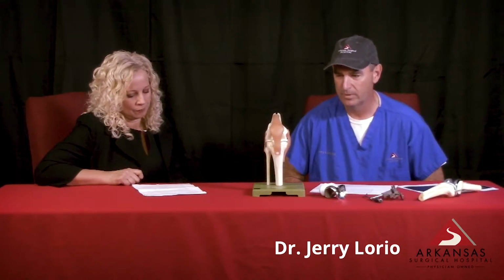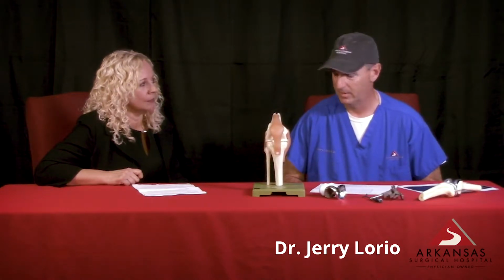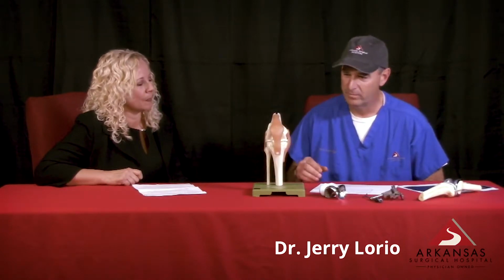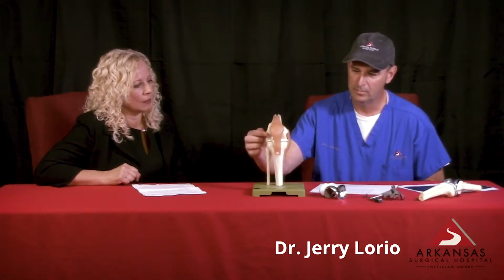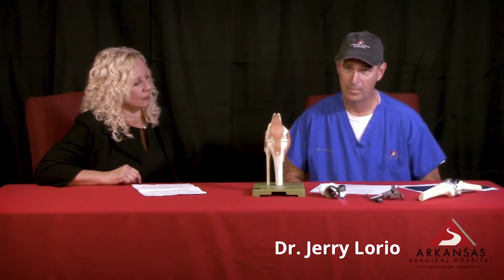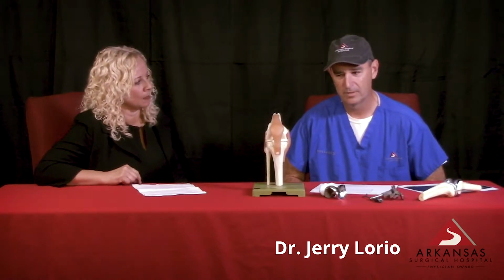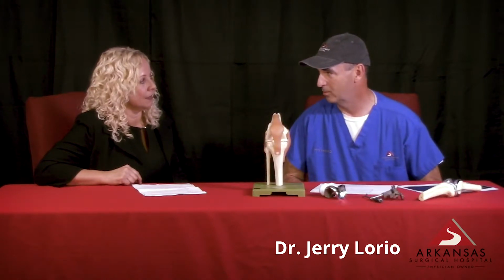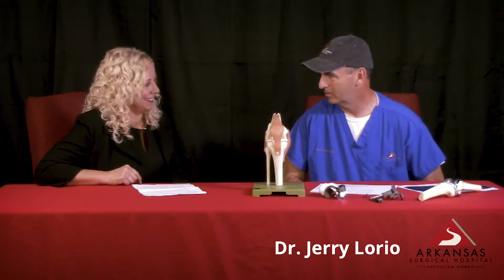Traditional joint replacement surgery for a knee, when I trained, we had different sizes of the implants, but we cut everybody in 5 degrees of valgus, 3 degrees of rotation. That's how you rotate the component and put the tibial implant in the exact rotation, and then we would balance the soft tissues to that. And over time, if you get a severely deformed knee, you have to release everything, and it's wobbly, and then you put in this constrained component, and that always drove me crazy that it couldn't be perfect.